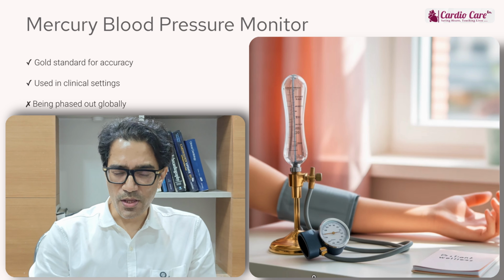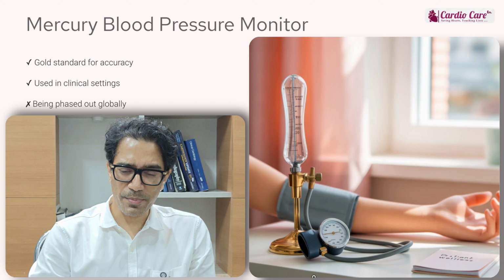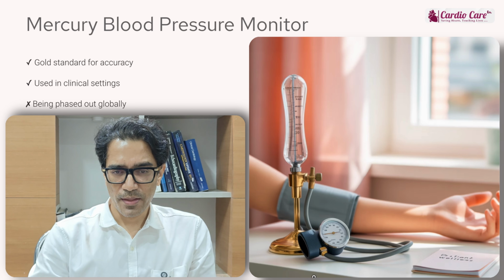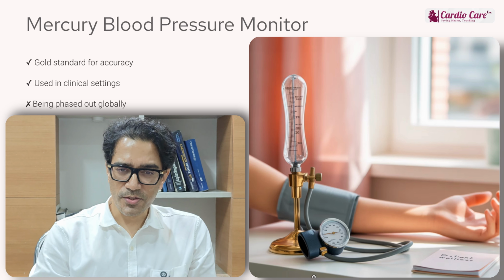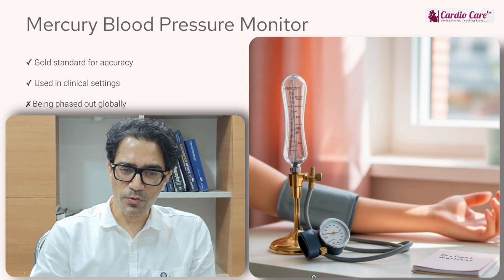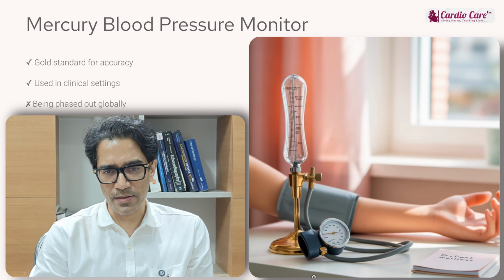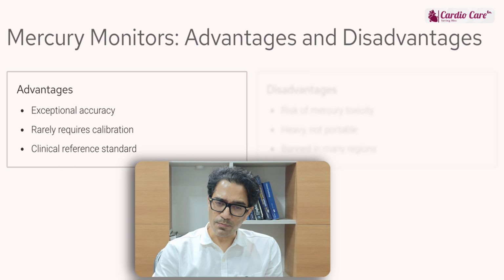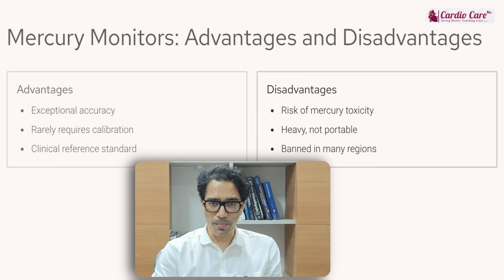And second, it is not user friendly. To have proper blood pressure monitoring through a mercury based device, you require a stethoscope and proper training. You have to be a doctor or a nurse or a healthcare professional, and you need to be adequately trained to check BP through these mercury devices. So it is not user friendly for day-to-day use by lay people. Although it is the most accurate, the gold standard against which all other BP monitoring devices are compared, it is still not user friendly, especially for home use.